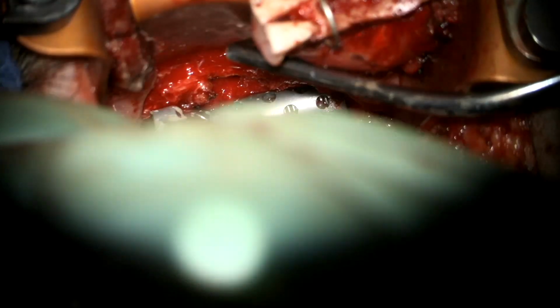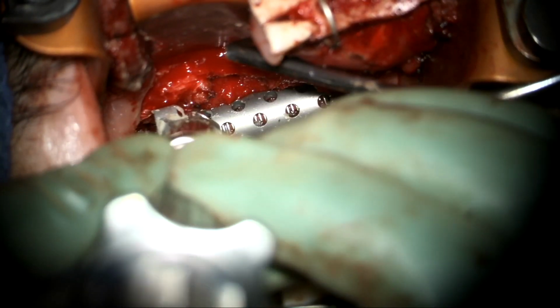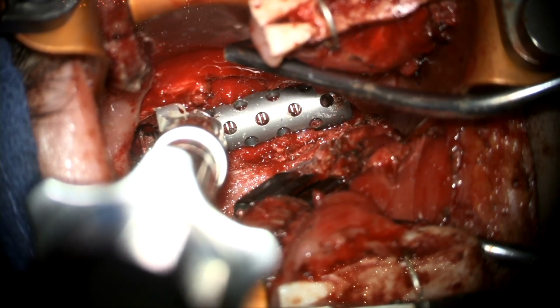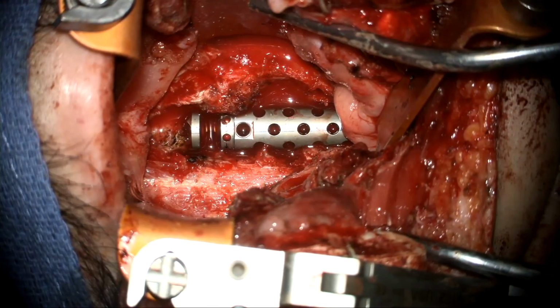Here we see the cage being expanded, and here we see the cage in its final position.